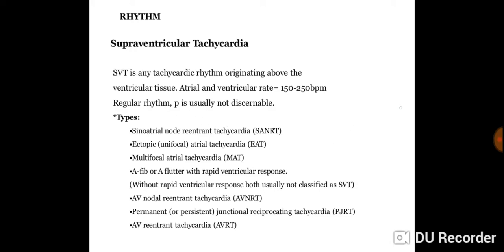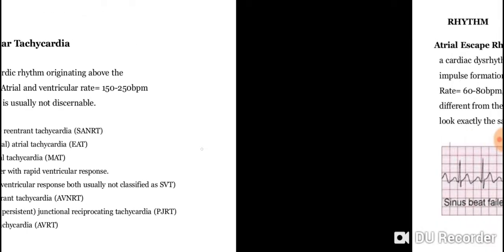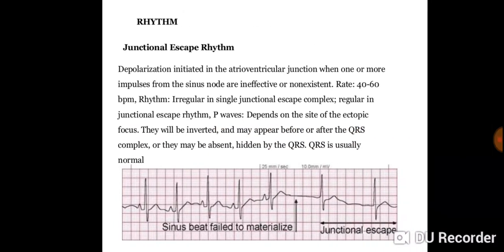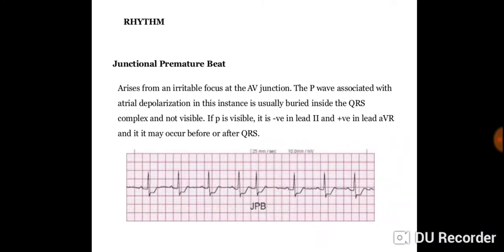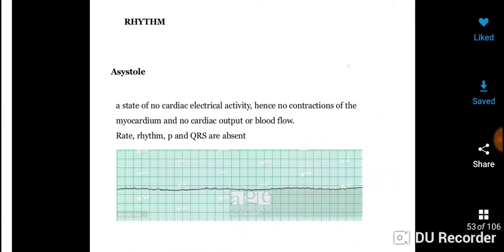These are the examples, usually does not come in your exam. Neither does this or this or this or this. So let's get to things that do.